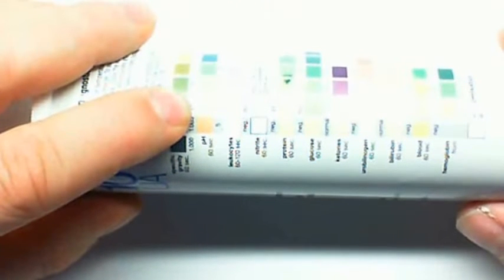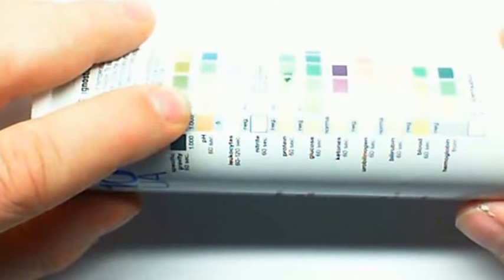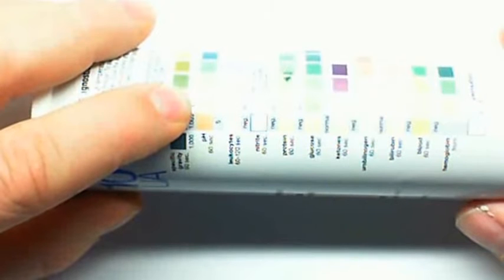A urinary tract infection is a cause of basic pH because certain bacteria will break down urea, and urea is generally an acidic source in the urine, so if that's broken down by bacteria, it'll turn the urine basic. So if there's bacteria that are getting rid of the urea, that'll turn the urine basic and indicates a bacterial infection.